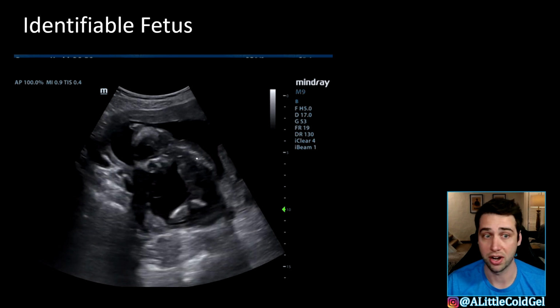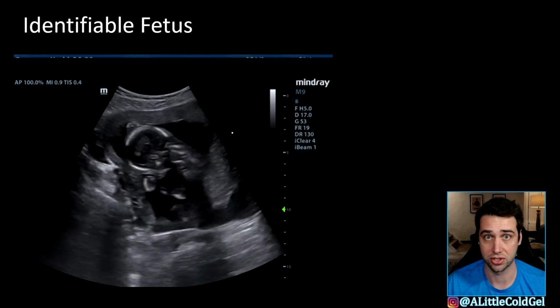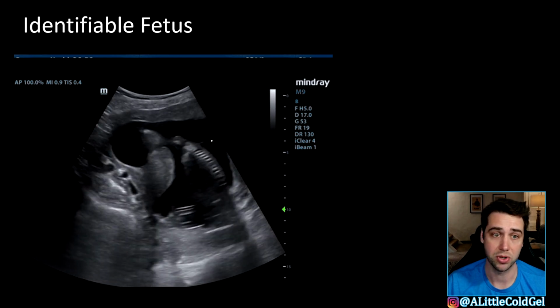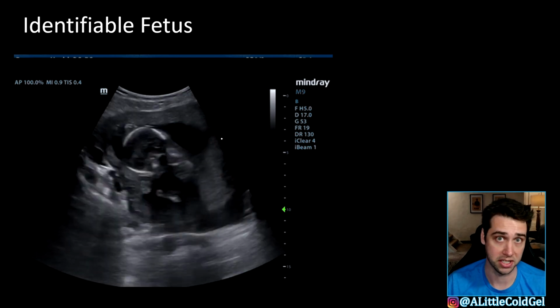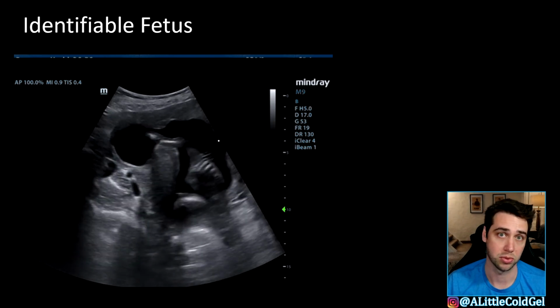As you move on, you're obviously going to see an identifiable fetus within the gestational sac. And at this point, you're going to be looking for other things like where the placenta is, what position the baby's in. But those are all things we'll cover more in the pathology series. So that's basically it. I hope you guys enjoy doing some OB scans. It's probably one of the most fun scans to do in the department. Reassure your patients at the bedside, and it's fairly simple.